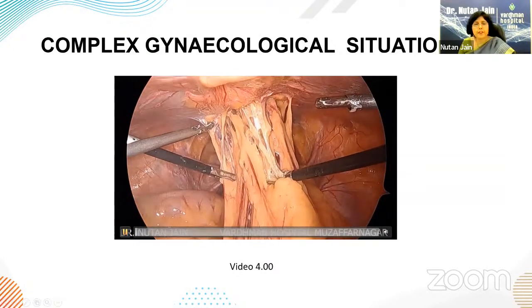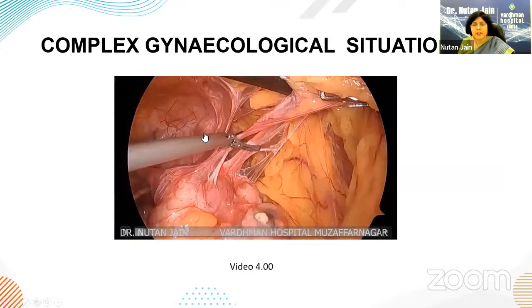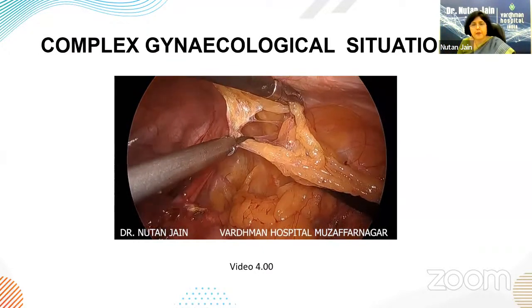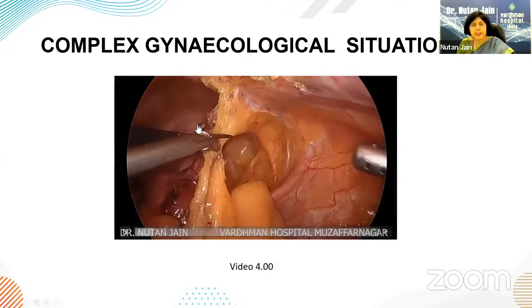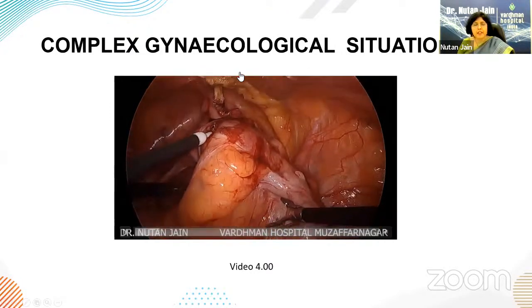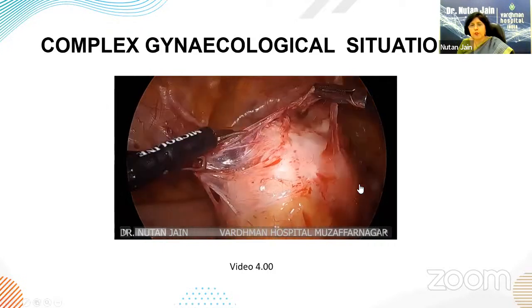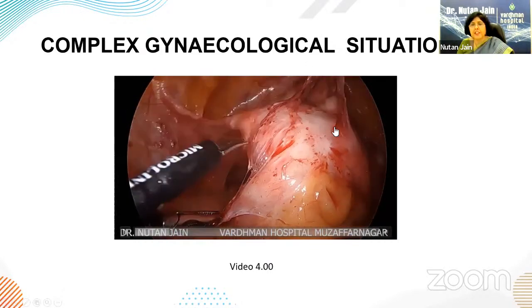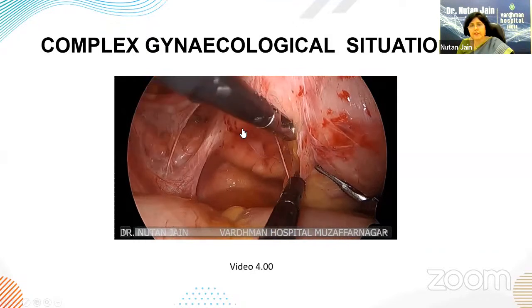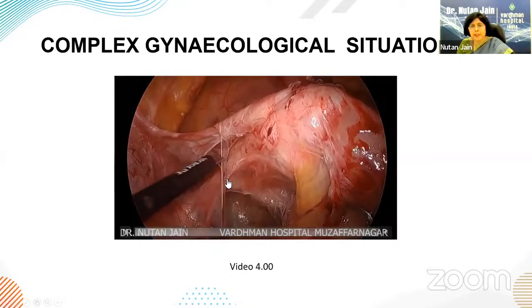As expected, she had previous 2 endometriosis surgeries and 1 cesarean section. So there are a lot of adhesions from the omentum. We should always do a 360-degree check for omental adhesions to see whether the bowel is involved in them or not. And in this case, because the bladder was lacerated in the previous C-section, if you see, the uterus is totally covered by bowel from three-fourths of the sides and by the bladder anteriorly. So we have injected huge amounts of vasopressin, and I'm starting in the same manner, opening up the posterior leaf of the broad ligament, trying to find the cotton candy space, the bubbles as a few people were referring to.